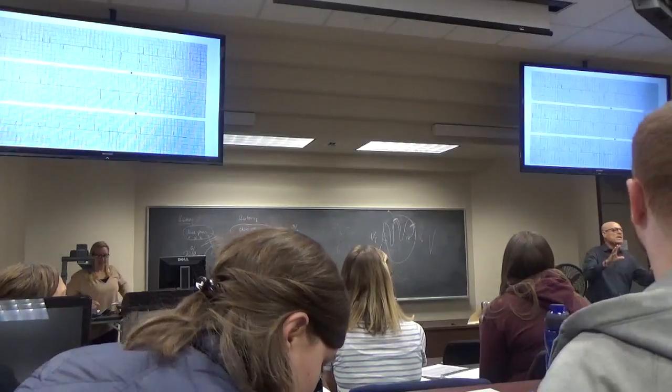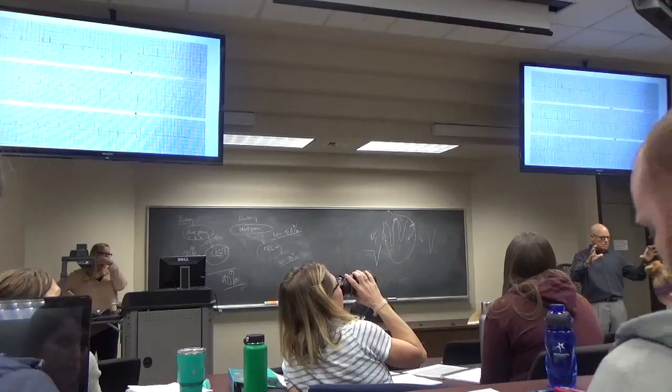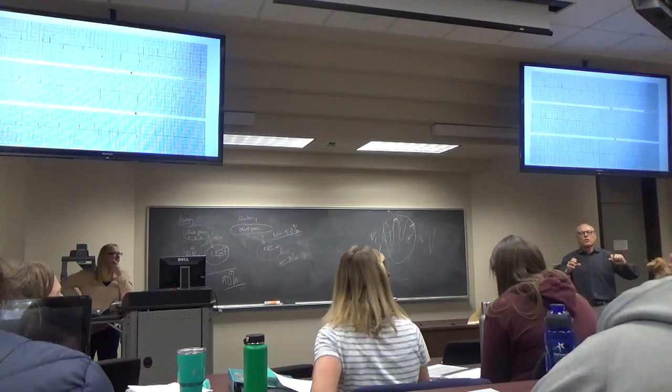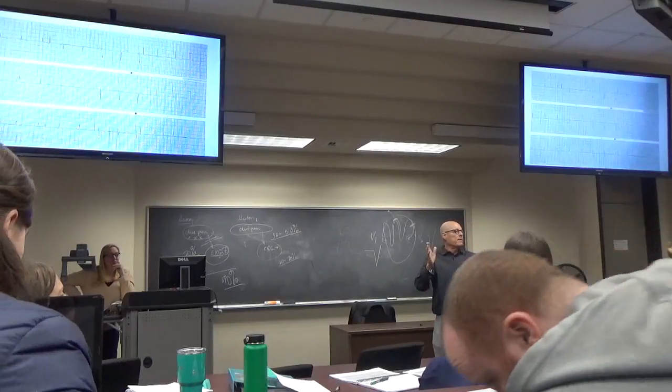But what Jacob said is look for contiguous changes. If they're not contiguous changes, there's probably something weird going on in that lead.